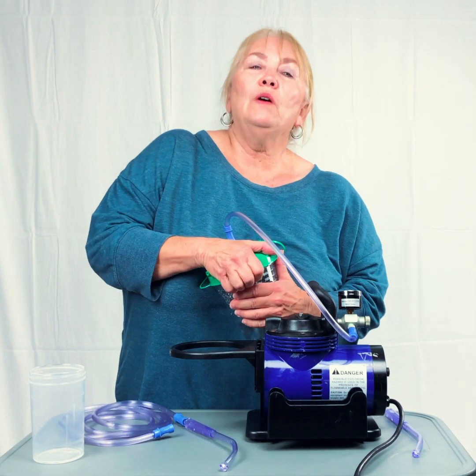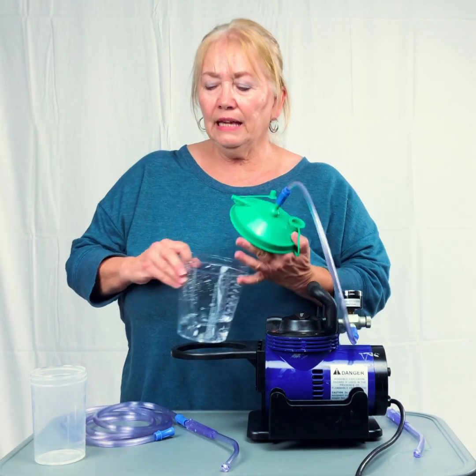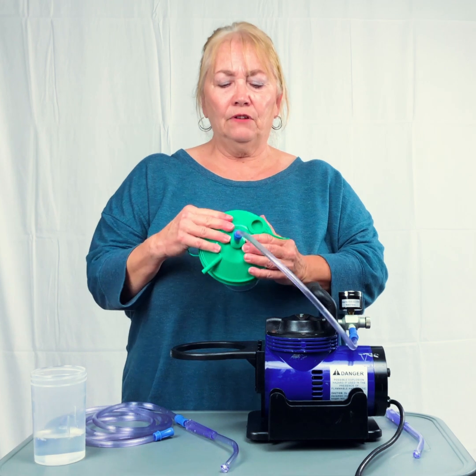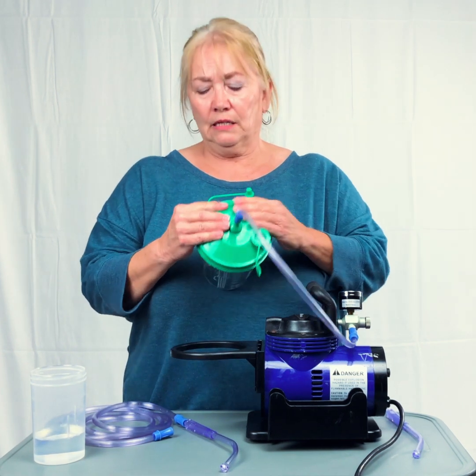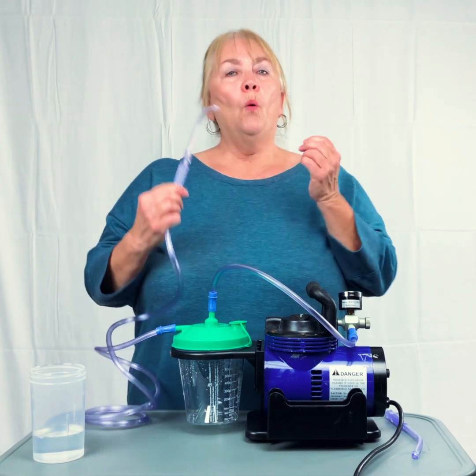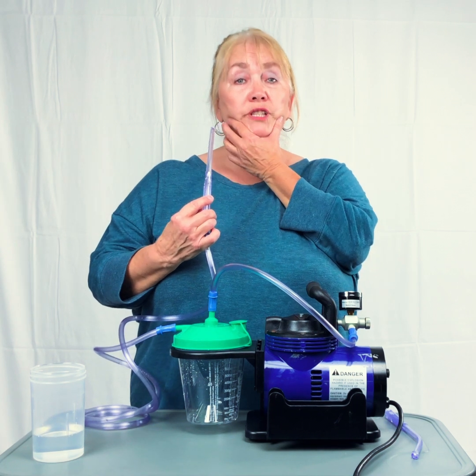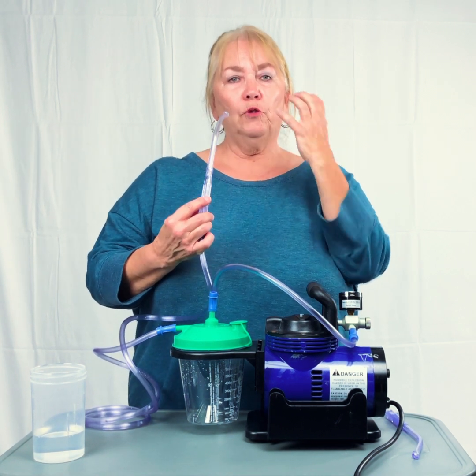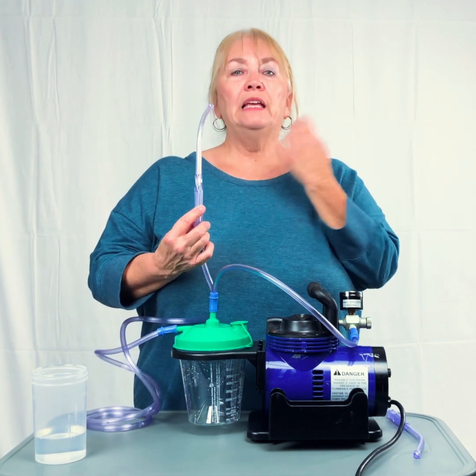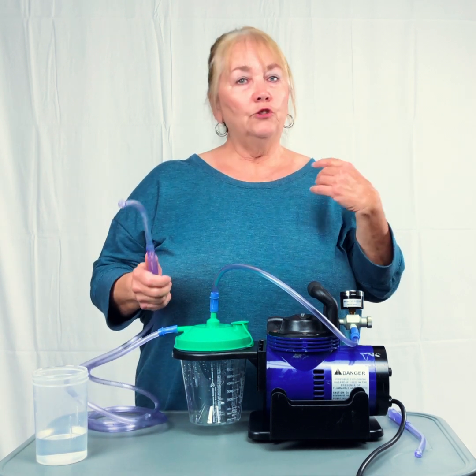A lot of times I get a question and they'll say, when I use the yankauer in the mouth, it's not getting anything. Everything works, but it's not sucking anything out. One of the things you have to do is when you put this in their mouth, if they can close their mouth, close their lips around it, it creates a closed environment, and so it will suck the secretions out. If not, if you can just gently close their lips around it, then you should be able to get some suction.